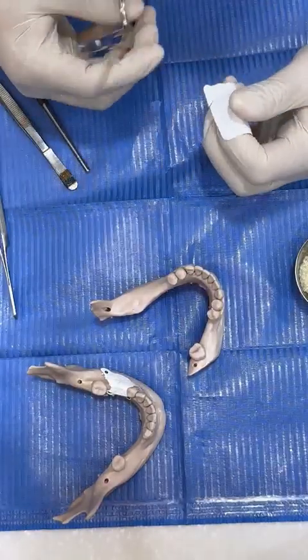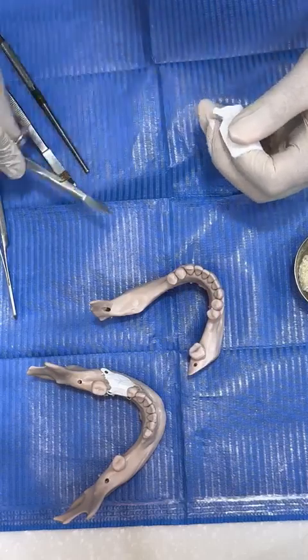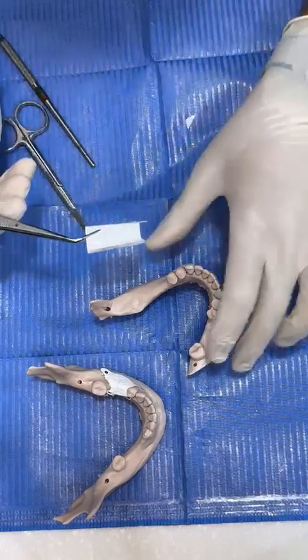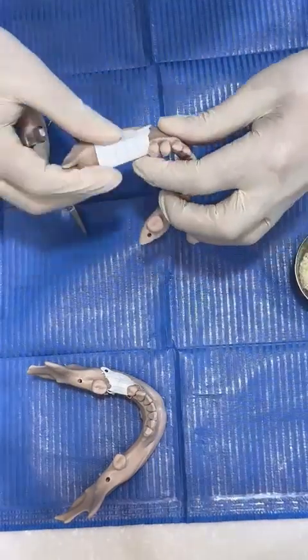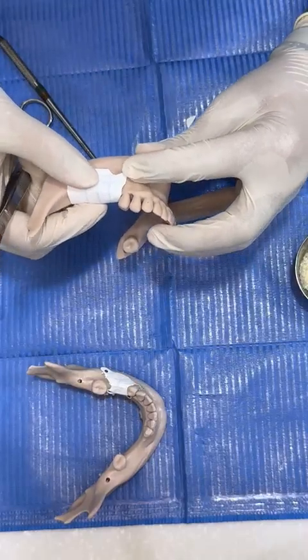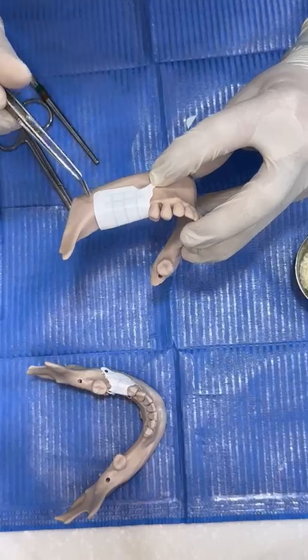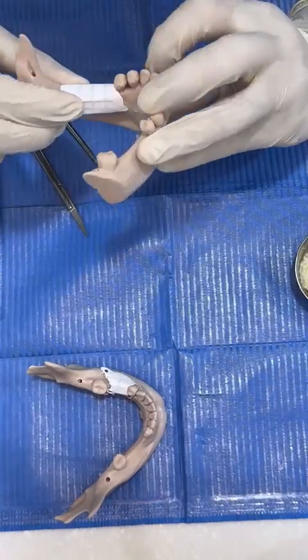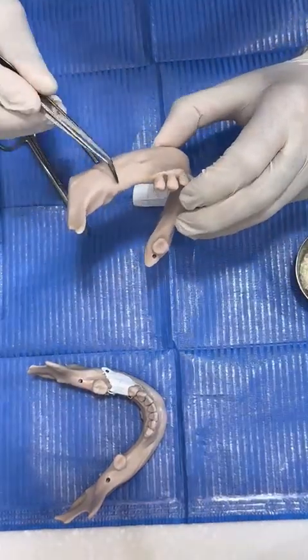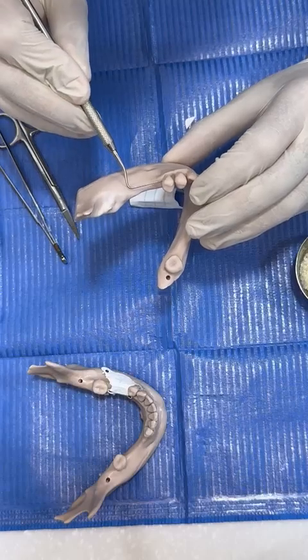Here. And here. So now let us see how it's going. Now I am away from the mental foramen. You can put your screw here and you continue the fixation all around. This membrane is a bit too long, so I want to end, for example, in this area. As I saw before, it's around 15 millimeter.